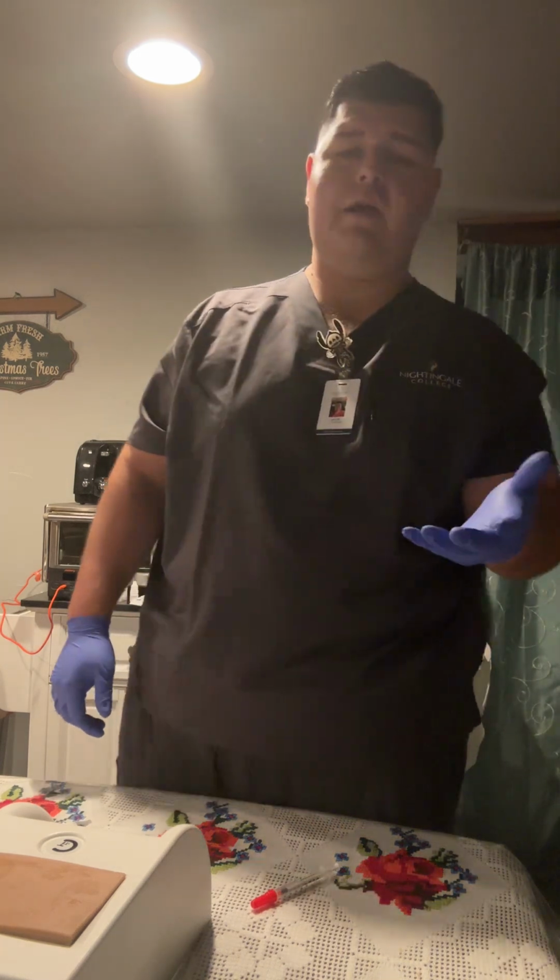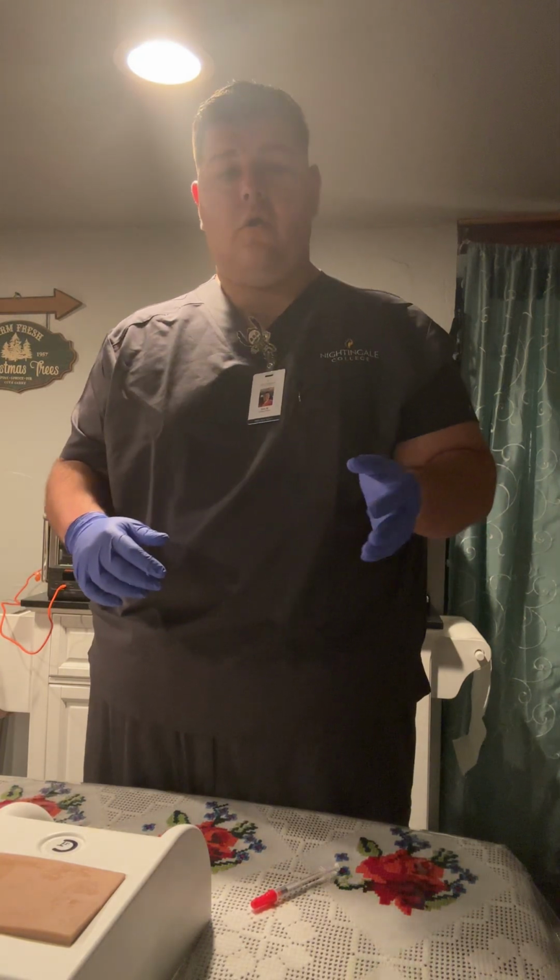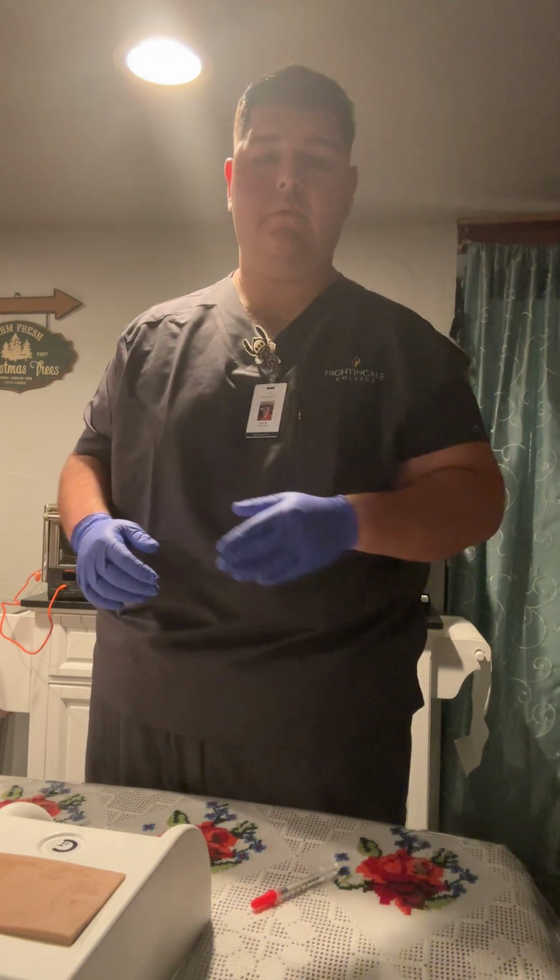So after selecting the site, I want to assess the site. I want to make sure there aren't any lesions, any discoloration. I want to assess for any tenderness, and essentially I want to ensure that the site is acceptable. Then I would get an alcohol wipe and clean the site. Like I said, starting at the center and clean outward. When I'm cleaning it, I want to start at the center and clean outward about 2 inches.